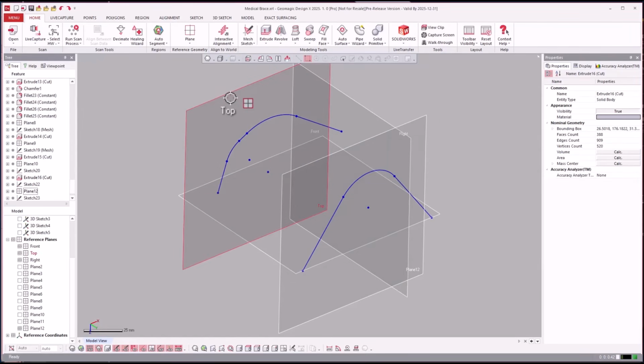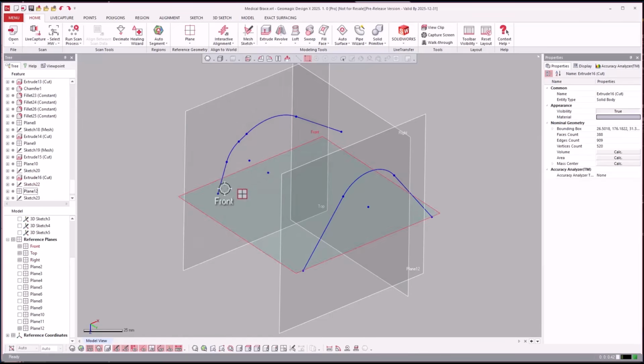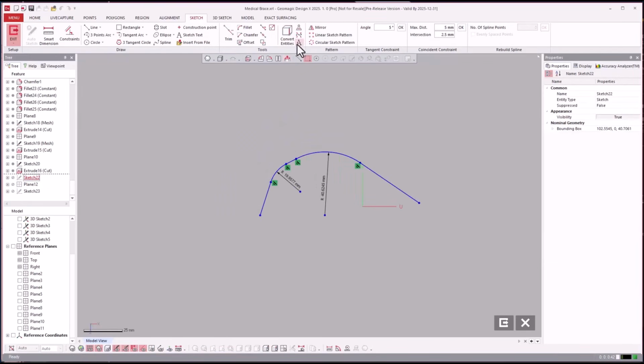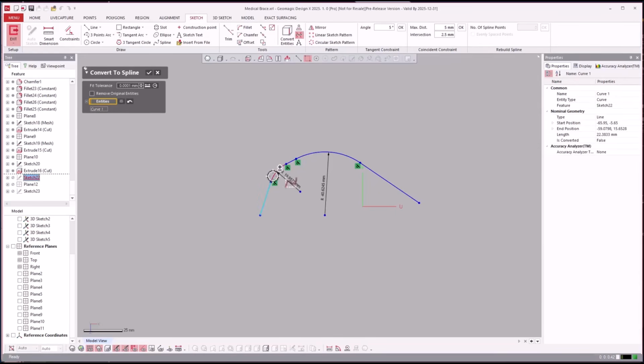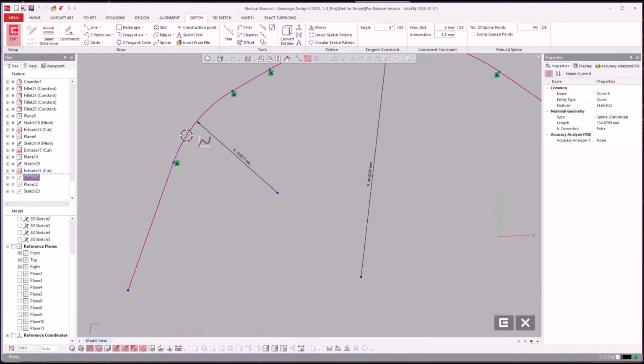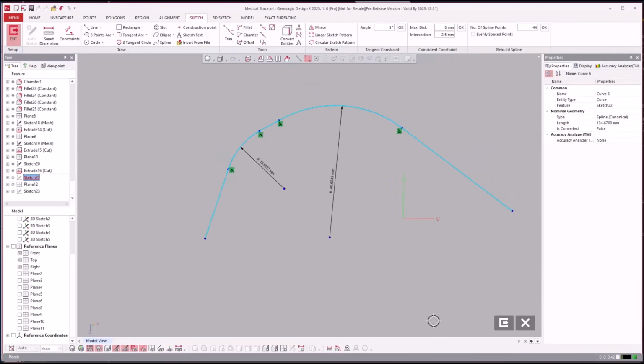But one thing that you can do to mitigate these dirty lofts by having different line segments inside DesignX is to come over here and I can edit this sketch, normal to, and then you'll see that we have this tool right here called Convert to Spline. And we'll just take forever clicking on all these. And then really tight fit tolerance. We're going to convert that to 1 single spline. So now when we roll over, it's going to be 1 object here.